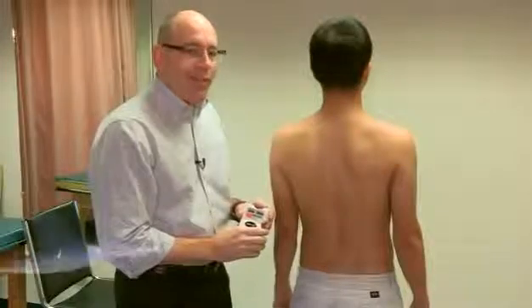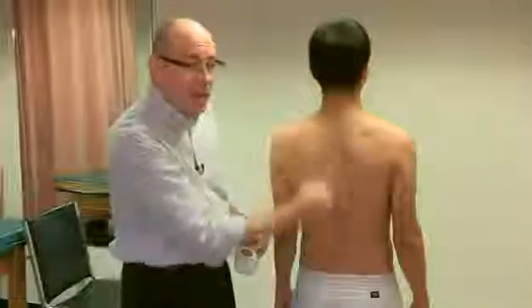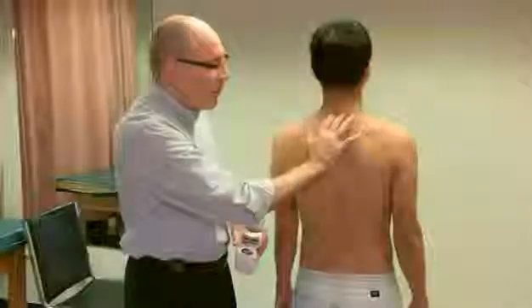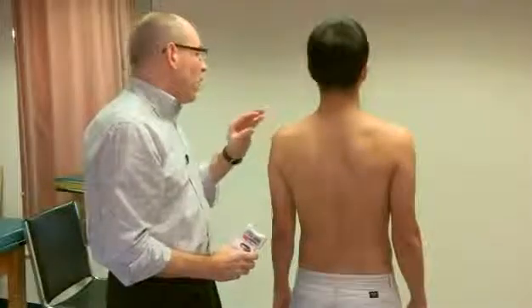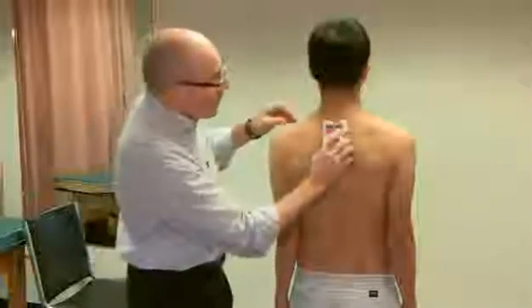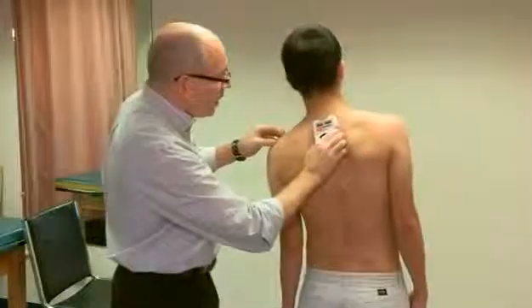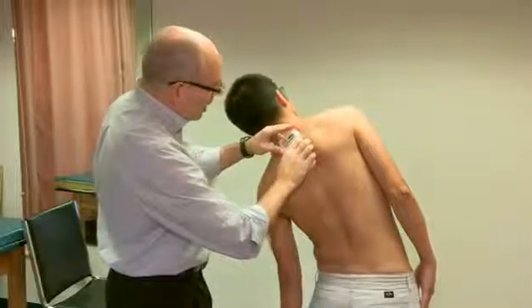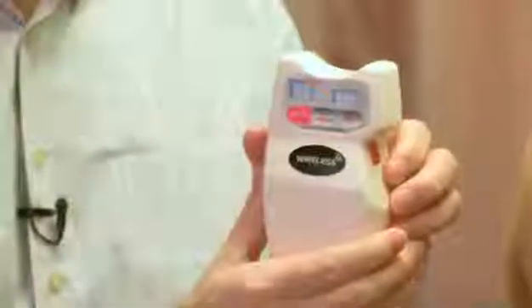Now we're going to look at lateral flexion of the spine. I'm measuring the entire spine, placing the inclinometer at the C7 level. The subject keeps equal weight bearing on both lower limbs with arms by his side. I reset and set it. Now bend to the left as far as you can. I set it again, and we ended up with 51 degrees of left lateral flexion.